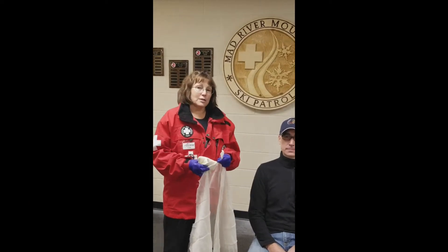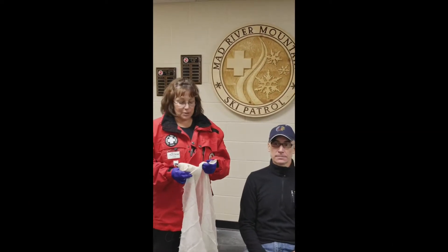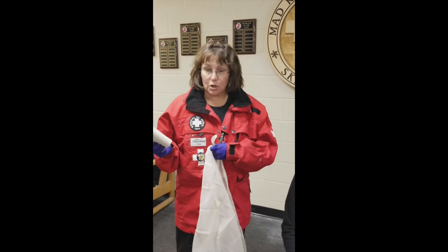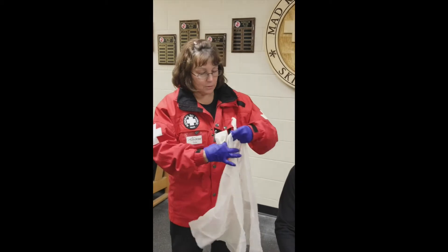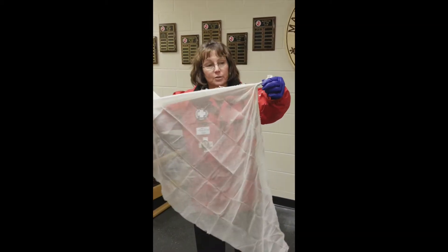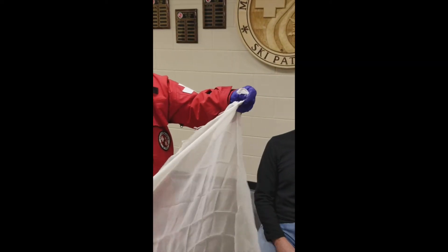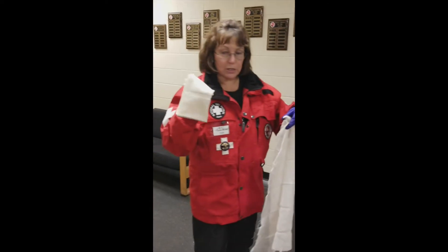Hi, I'm Cindy Watson with the Mad River Mountain Ski Patrol, and I'm here today to demonstrate the application of a sling and swathe. What you'll need are two cravats that you'll carry in your coat or in the training bag. You'll open up one cravat — I've tied a knot in one of the apex of this cravat, and the other one we'll just leave alone.